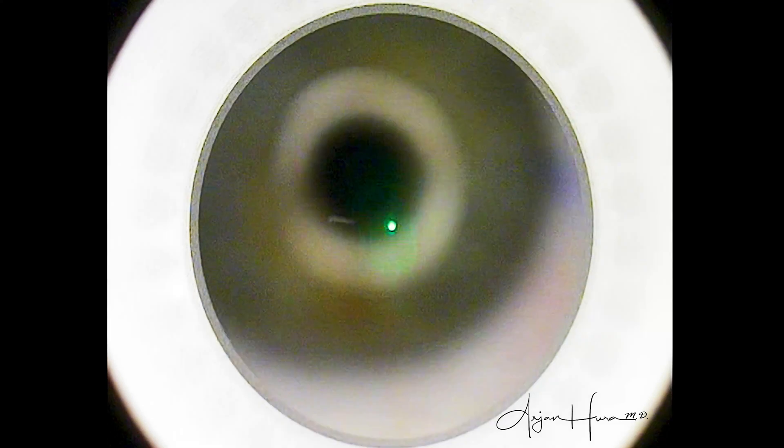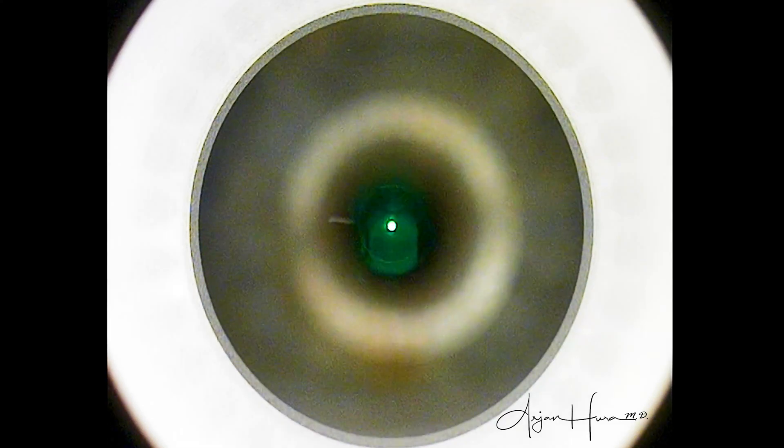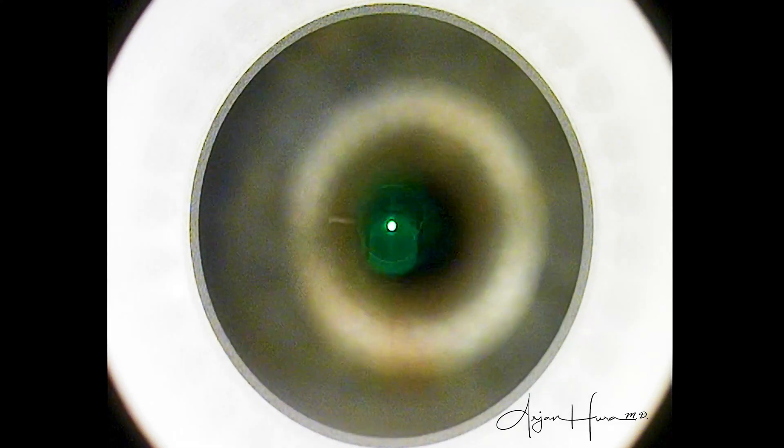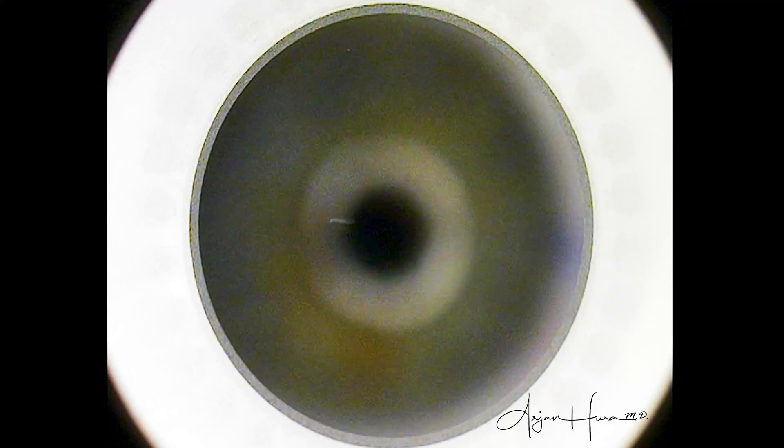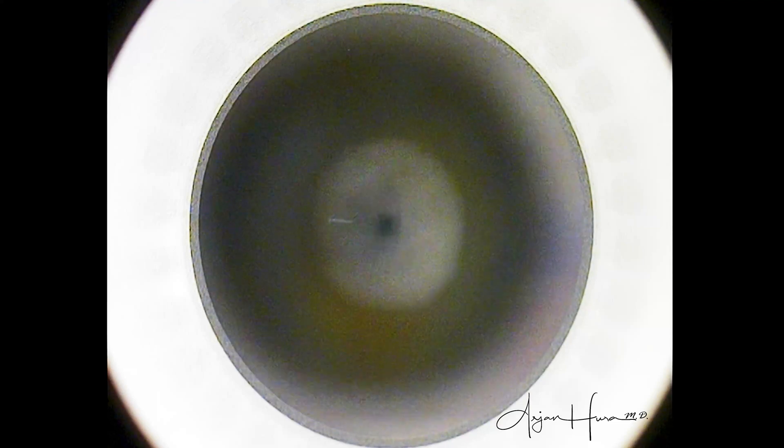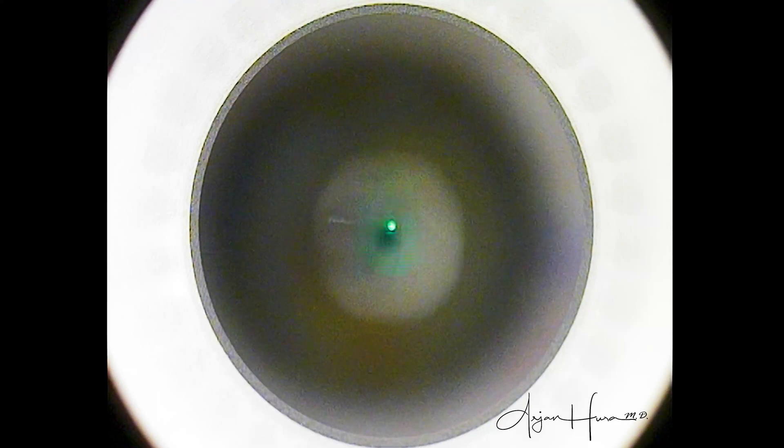Similarly, with SMILE, some surgeons prefer to create the lenticule, dissect it, extract it out, and then do the same thing in the other eye. However, I've found that it's more efficient to just create the lenticule in each eye, be done with the laser — the patient's relieved, the 48 seconds of treatment are over — and then proceed with the dissection and extraction.